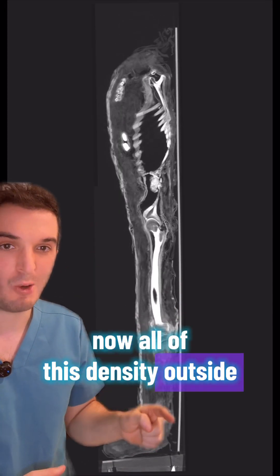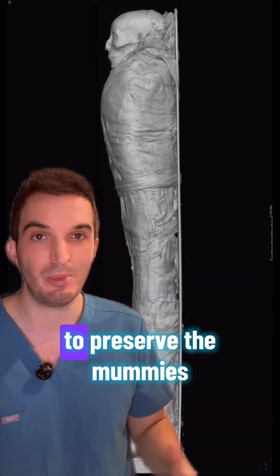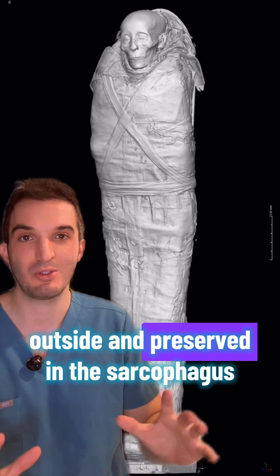All of this density outside of the body — I think that is like papier-mâché or whatever packing material they use to preserve the mummies before being wrapped on the outside and preserved in the sarcophagus.